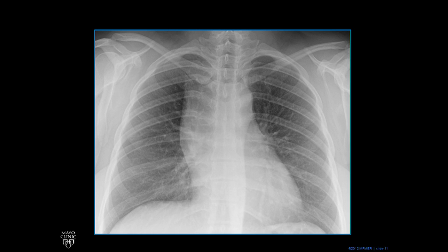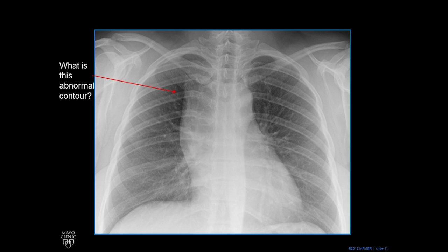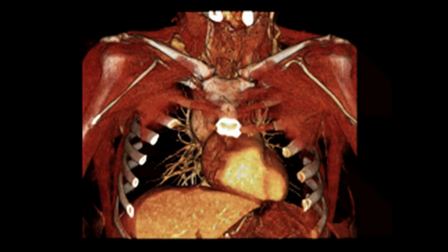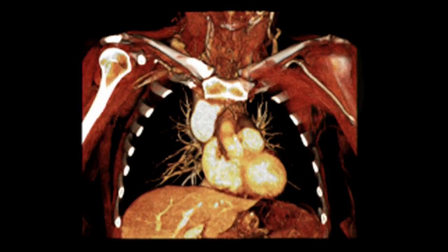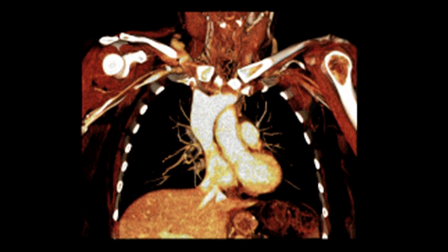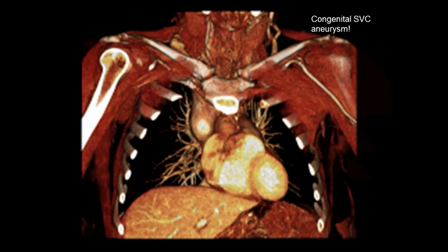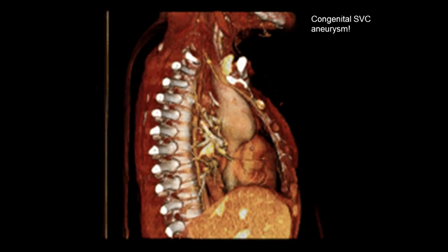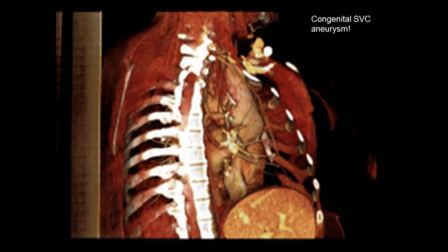Look at this case. This is not normal. What is this abnormal contour? In most cases, an abnormal contour in this spot would have to do with adenopathy or some sort of mass. But because the point of this talk is to show that that contour really is the SVC, we'll show this case. We fade away and overlay our CT scan — we peel back — and this is a congenital SVC aneurysm in a young woman in her 20s or 30s. You can see that that big structure is the SVC.